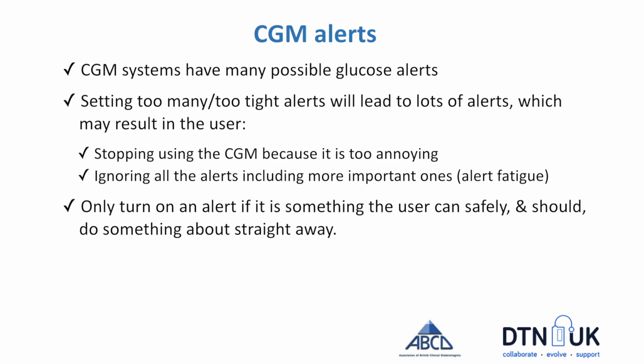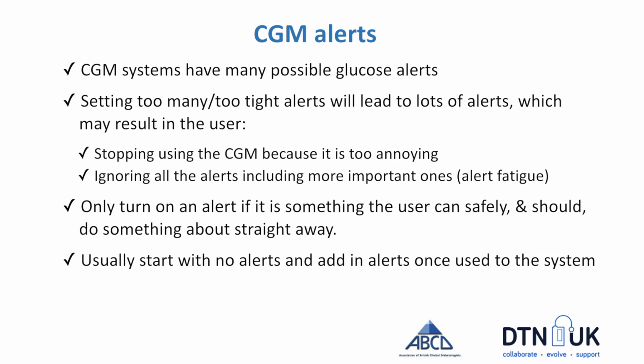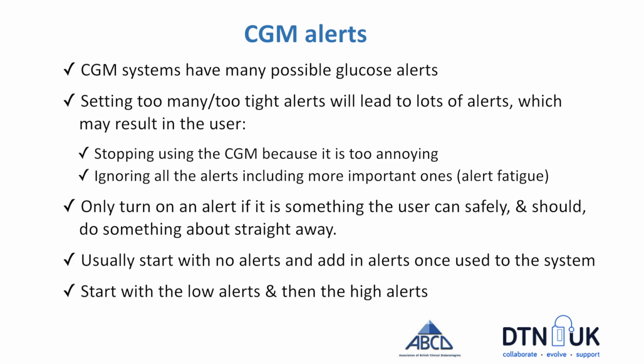When people first start using real-time CGM, we recommend to start with no alerts or very few alerts and only add in the alerts once you're used to the system. And generally people start with the low alerts and then add in the high alerts.